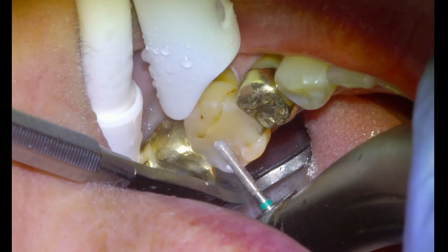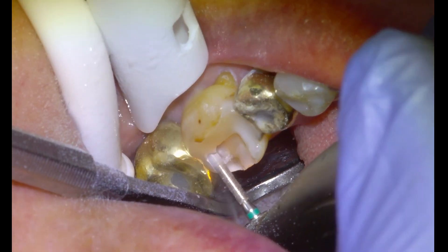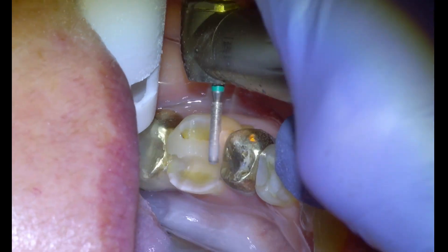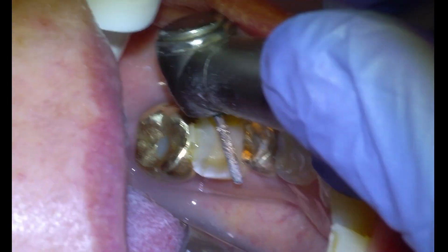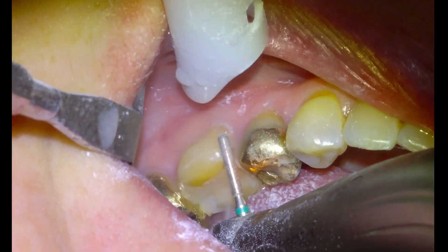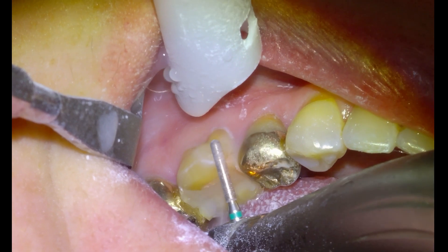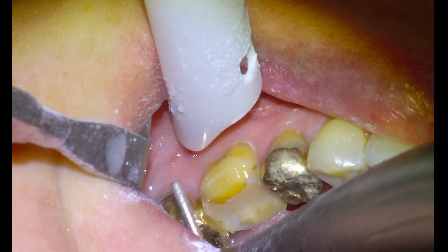We're going to get going with the crown prep. I'm going to take a KS1 burr coarse grit on a high speed and begin our occlusal reduction of the lingual surface, then the buccal surface — starting at the nine o'clock position, then the lingual cusp, then moving over to eleven o'clock for our buccal cusp. This is our functional cusp reduction, so this is an important surface not to under-reduce to ensure adequate thickness in the crown for fracture resistance.